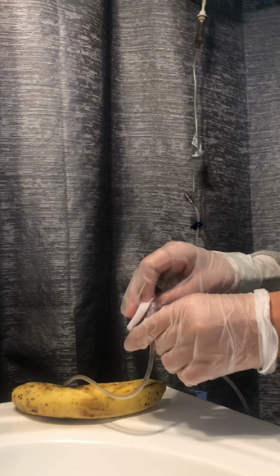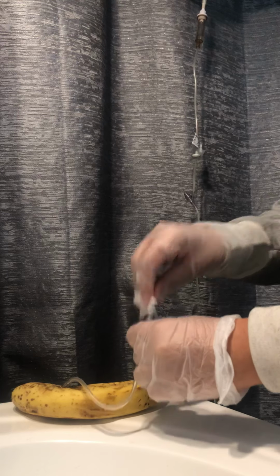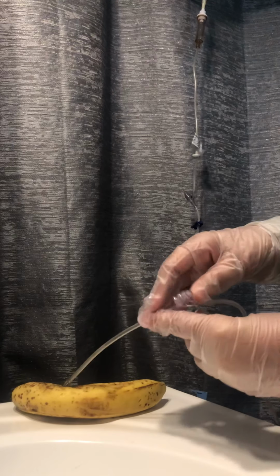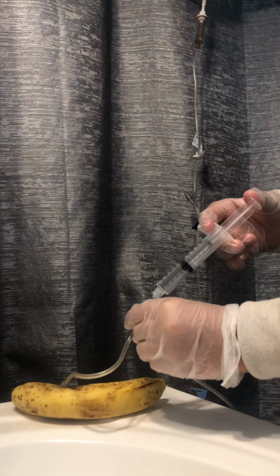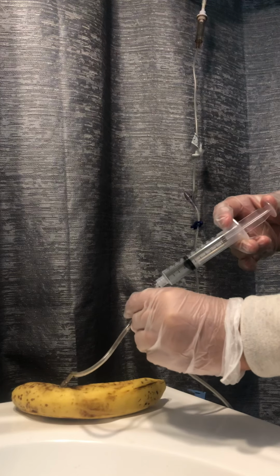Still watching our clock and with a continuous pinch. Putting it in slowly, continuous pinch at the 0.5 over 30 seconds.